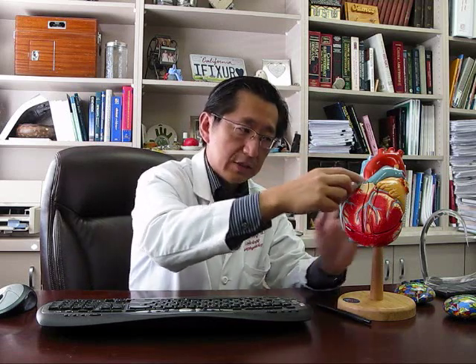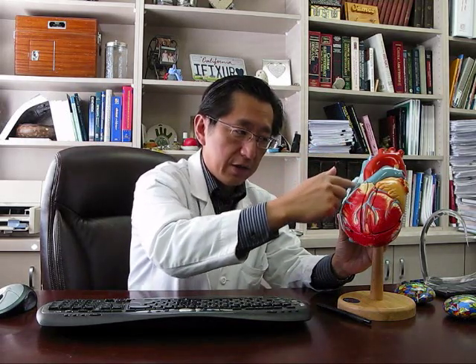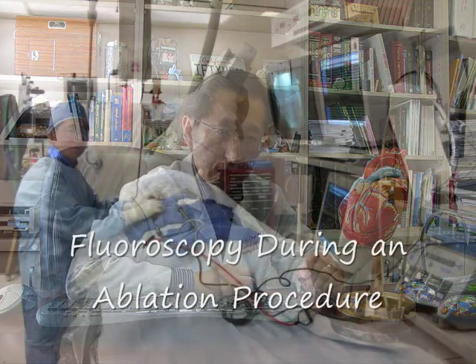In the procedure, we pass a catheter into the heart under what we call fluoroscopy. Fluoroscopy is an x-ray that helps us visualize the catheter in the heart in a real-time fashion. Catheters are passed through various access points, typically in the groin or in the neck, and are then passed into the heart through the vein, with placement guided by fluoroscopy.